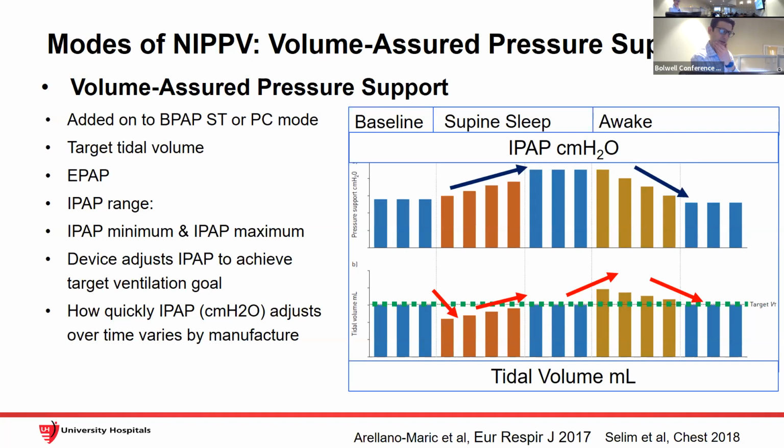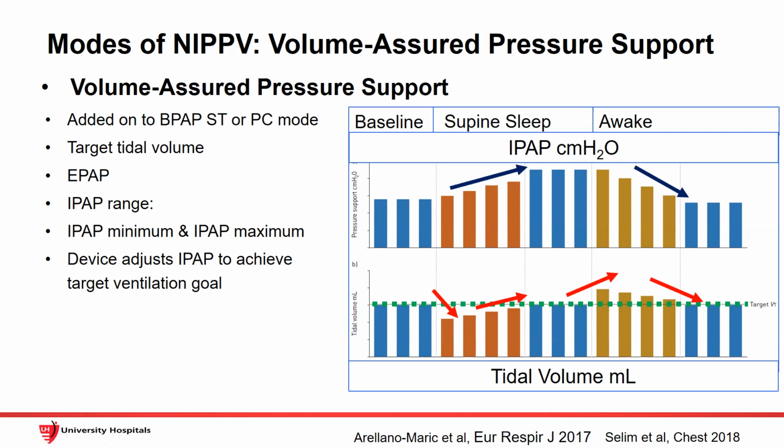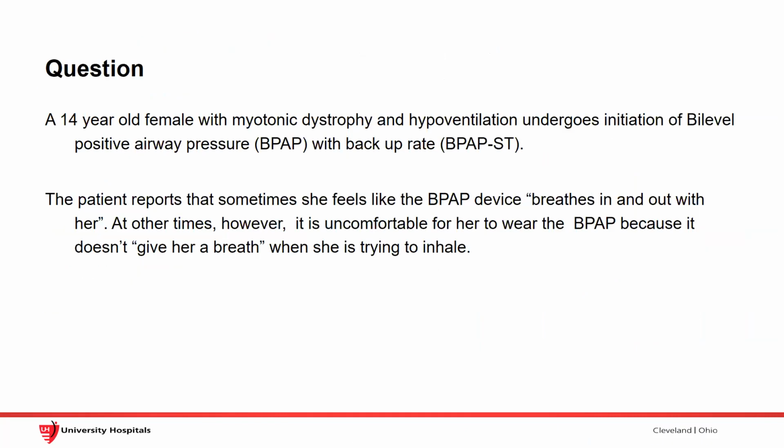Sushil, I don't have anything on that right now. The only other thing on the slide you showed about cycle and trigger is one other hint: in terms of figuring out what's up and down, look at timing. We know what the normal I to E ratio is.